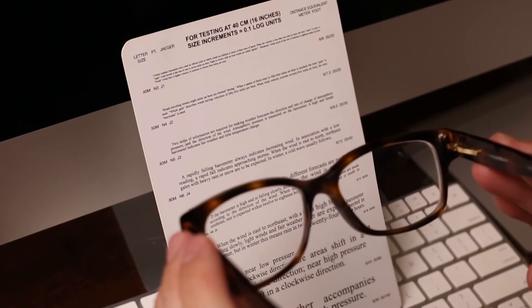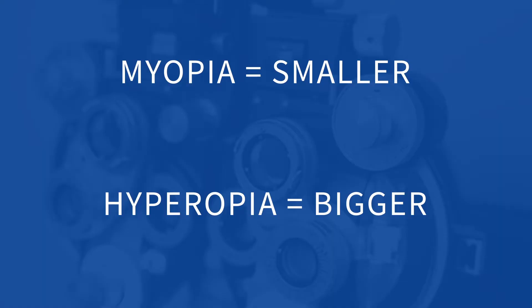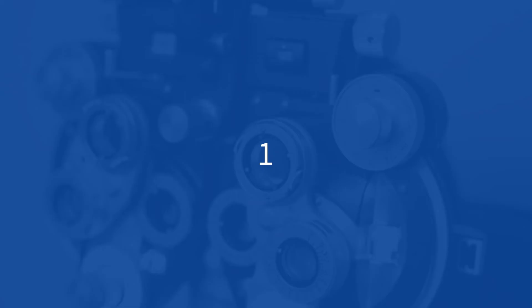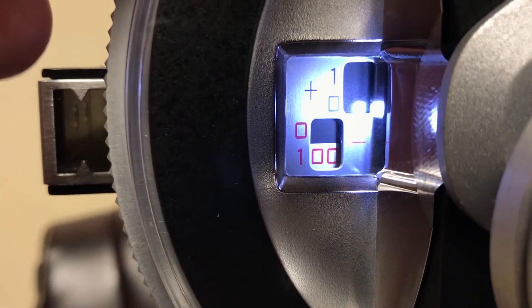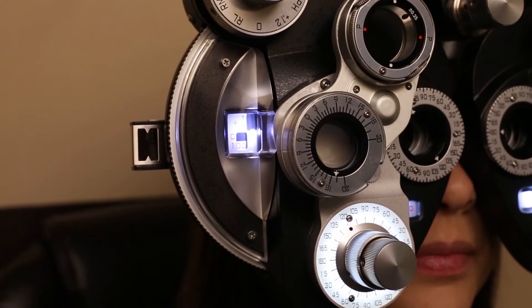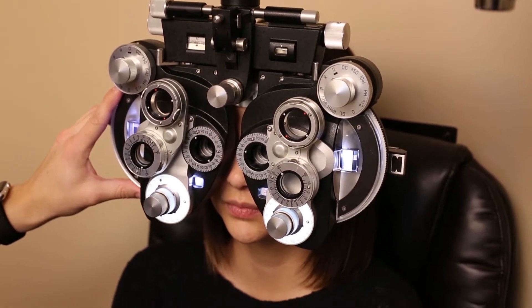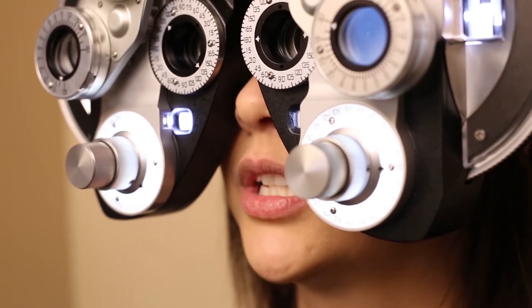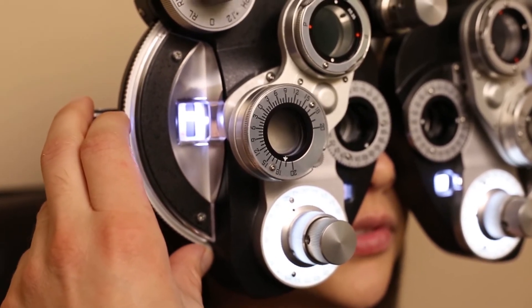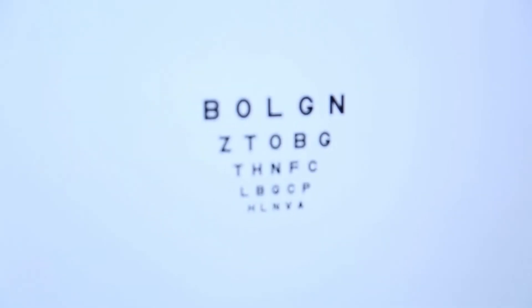First up is the sphere. If your patient is myopic, their glasses will make things look smaller; if they're hyperopic, their glasses will make things look bigger. We'll start with zero and say better one or better two — stick with one or two the whole time so you don't confuse everyone, including yourself. One is the current setting and two is the new choice. Make big steps to start if they're pretty blurry, usually a whole diopter at a time. Once choice two isn't making things better anymore, switch to quarter diopter steps to fine-tune. When the image isn't getting any clearer, we're done here.